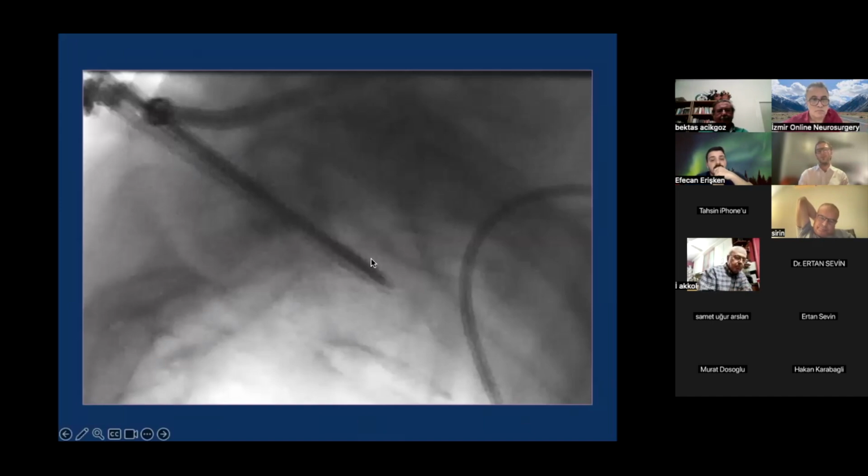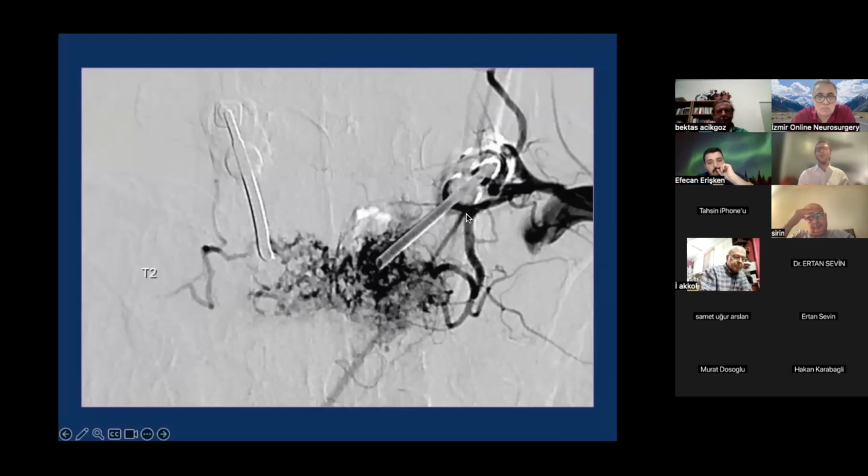So you see the positioning at the posterior third of the vertebral body. And to see where the alcohol will go, we always do a phlebography through the bone needle and see what happens. So we are injecting contrast material through the bone needle, and you see some vessels which are going in this big vessel and with another vessel going upward.